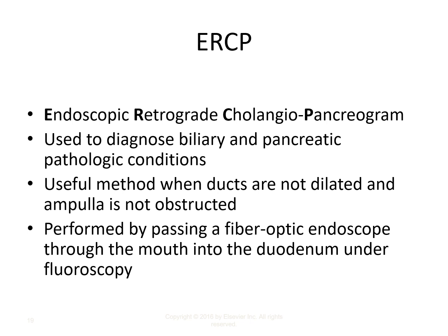Now, the endoscopic retrograde, that's on the gastroenterologist. They have to pilot the endoscope through the patient's mouth, down their throat, down the esophagus, through the stomach, into the duodenum, and then they also have to cannulate via catheter and wire the hepatopancreatic ampulla and the sphincter of Oddi, and then inject the contrast through their endoscope.